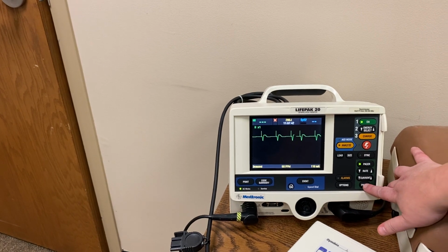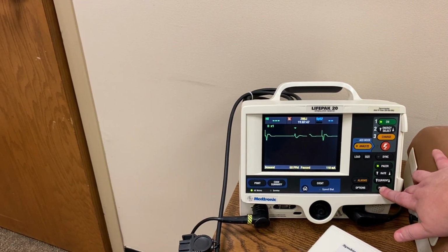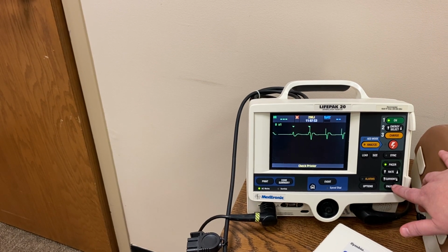You can also press pause here, and it's going to show you the patient's underlying rhythm. Once I go off of it, I'm going to get capture again.